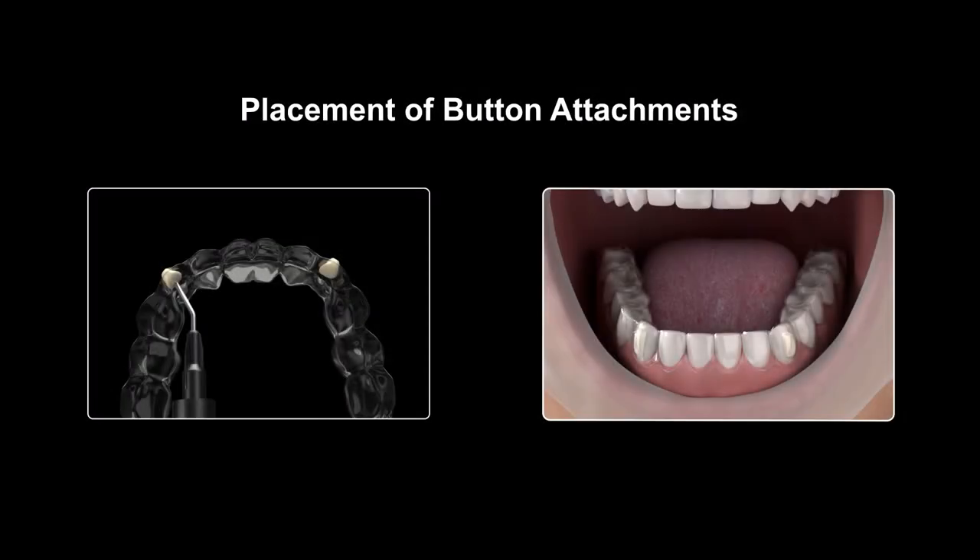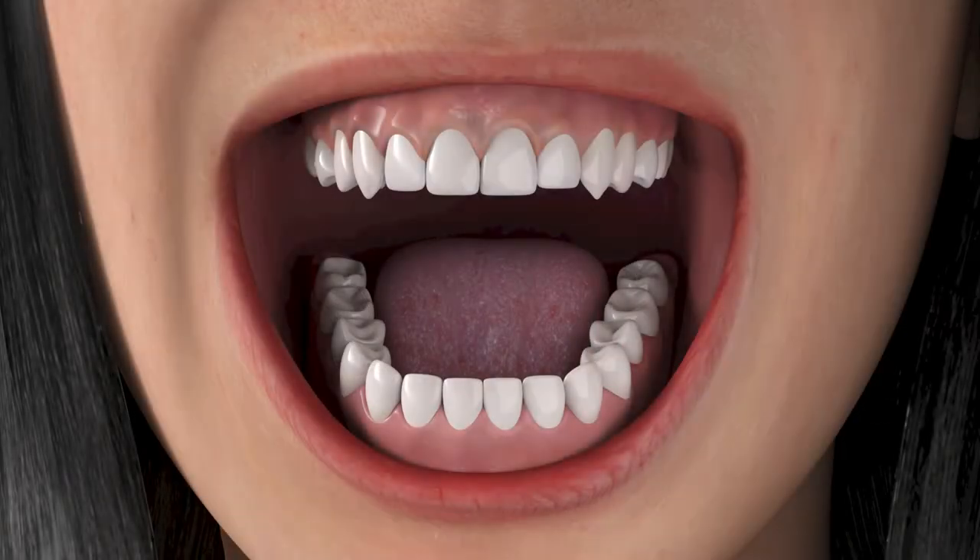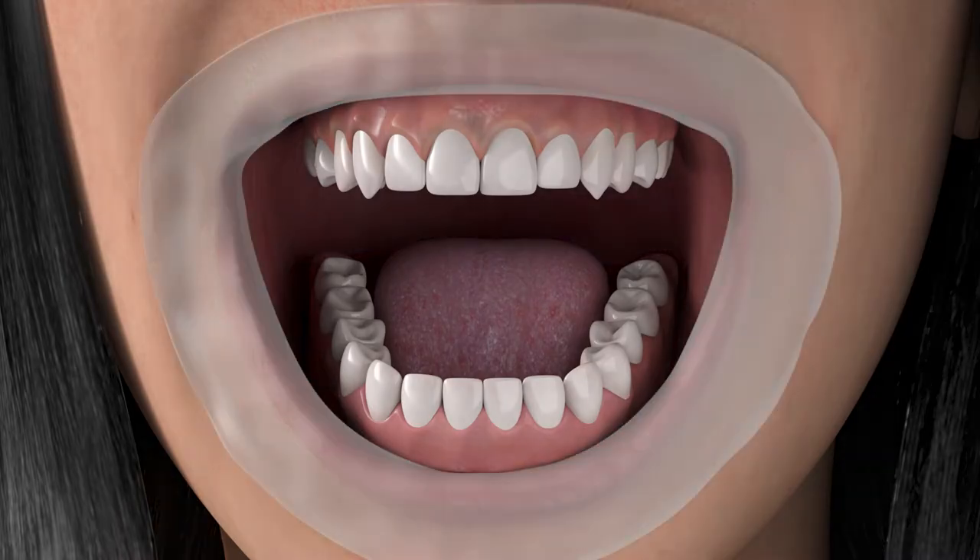Placement of button attachments. Place retractor into mouth. Apply etching material to the appropriate teeth. Rinse and dry the treated areas.